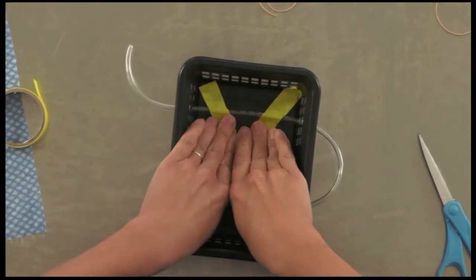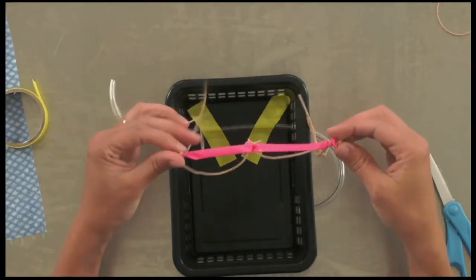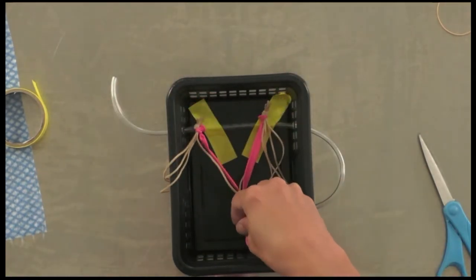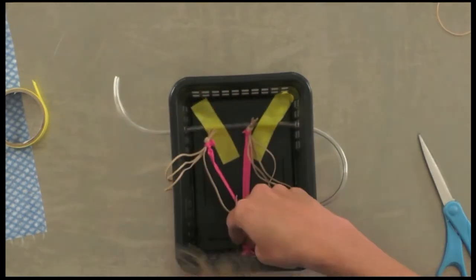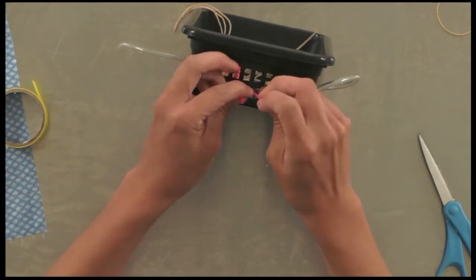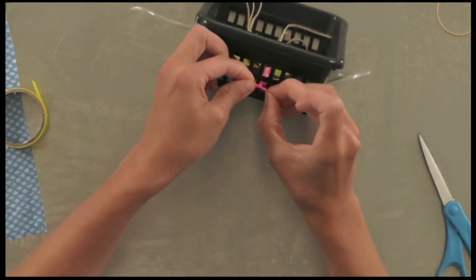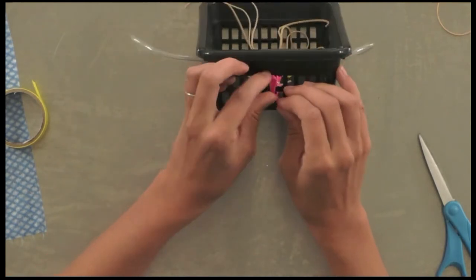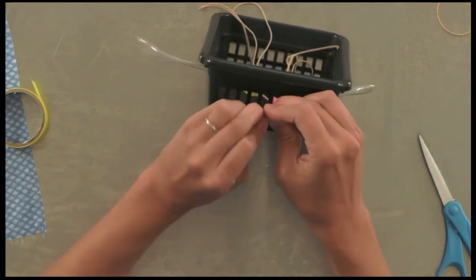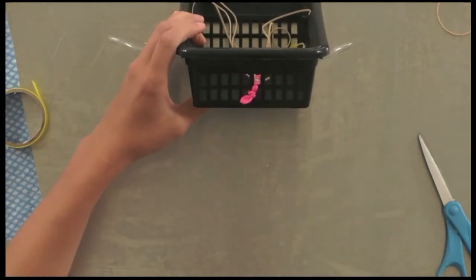Later we'll put suction cups to secure it to the table. For now, place your uterus and ovaries into your tray. I've tied a knot to secure it to the tray — you could also use tape. If you've got little legs on your uterus, go ahead and tie a knot or use tape.